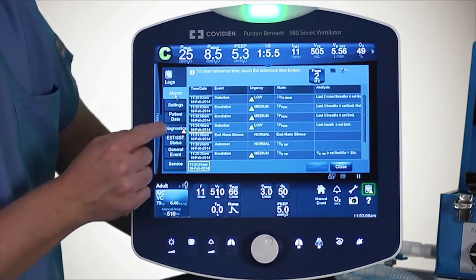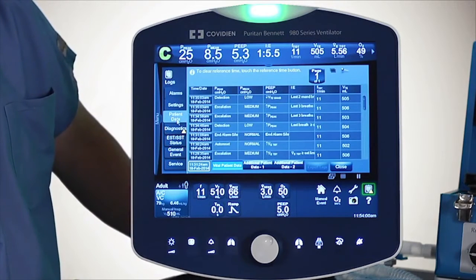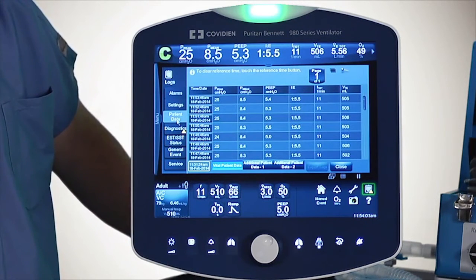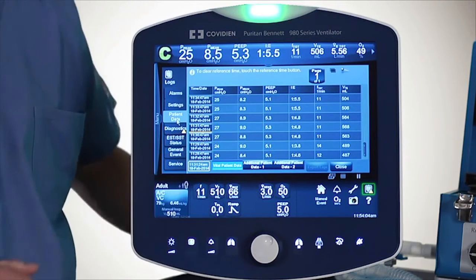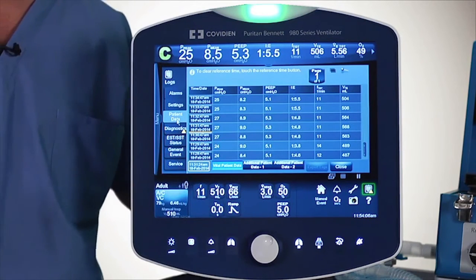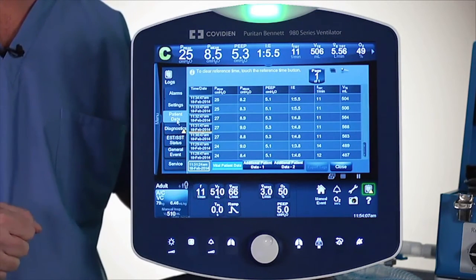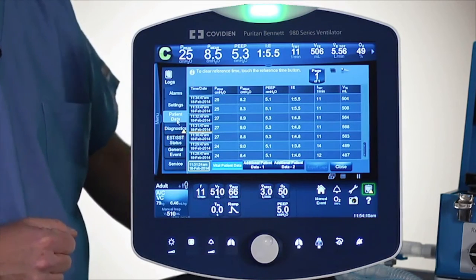And then if I go down to the patient data section, in the same way it will find that setting change and draw that yellow line to show you what happened before and after from a patient data perspective.